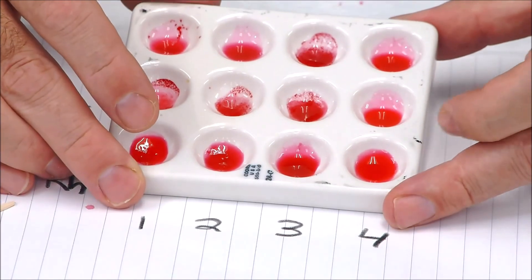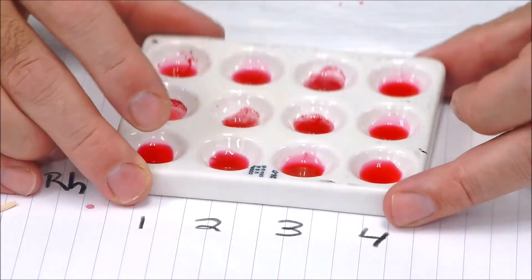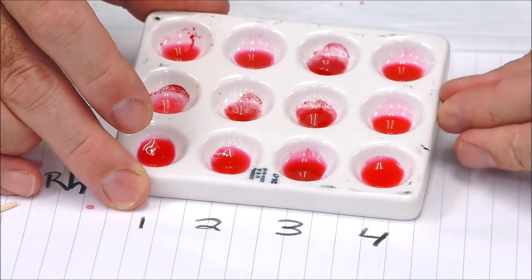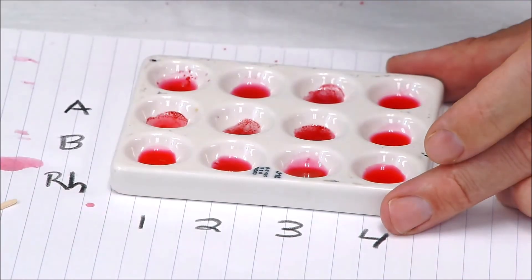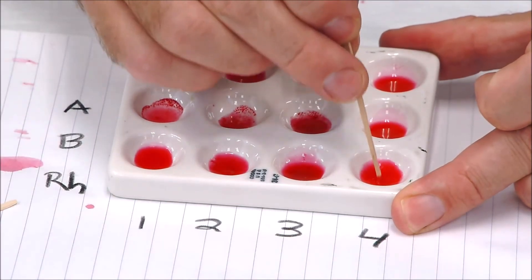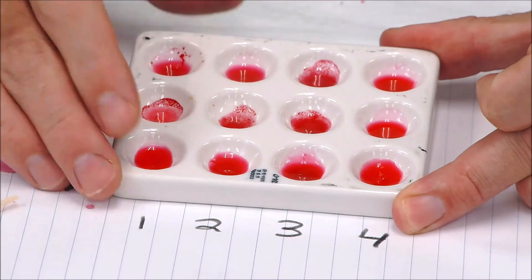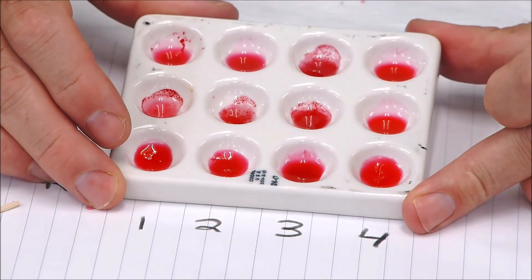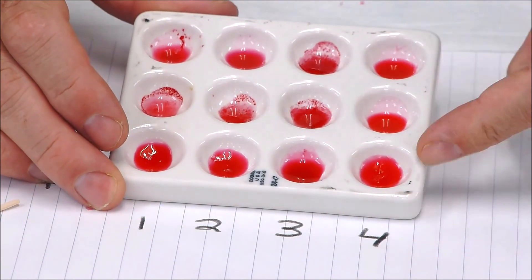And then sample four here—we have what looks like no clumping in any of the first two wells. And we'll go ahead and just see what the fourth well looks like. Again, real blood doesn't gel like that, but we'll just say that the Rh here, for sake of argument, is positive. So be able to figure out what that blood type is.